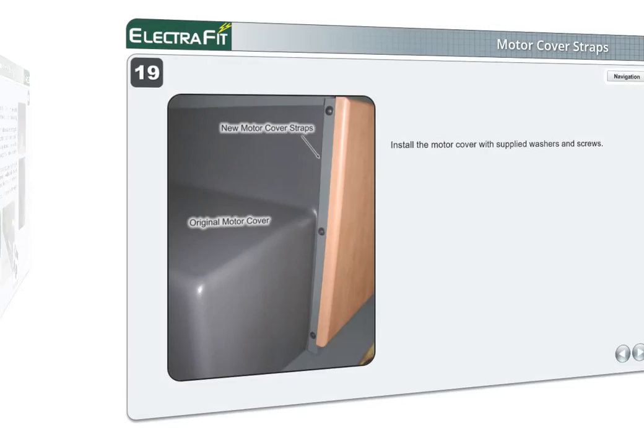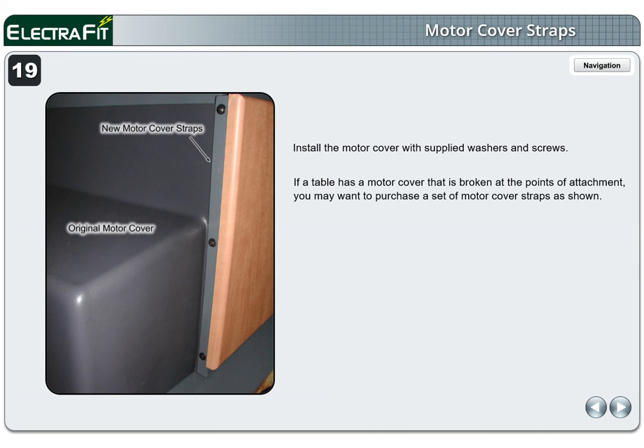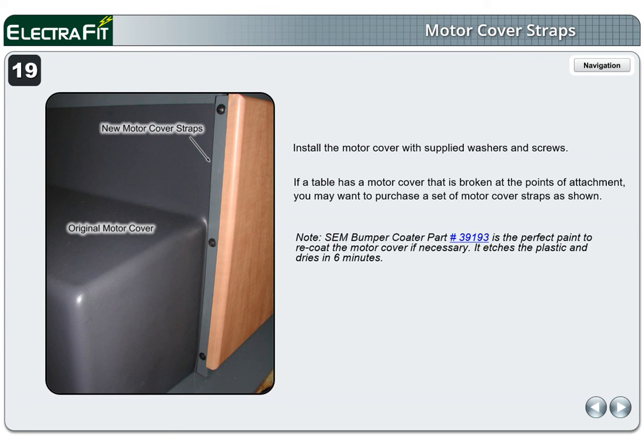Page 19. Install the motor cover with supplied washers and screws. If a table has a motor cover that is broken at the points of attachment, you may want to purchase a set of motor cover straps as shown. Note: SEM Bumper Coater Part Number 39193 is the perfect paint to recoat the motor cover if necessary — it etches the plastic and dries in 6 minutes.